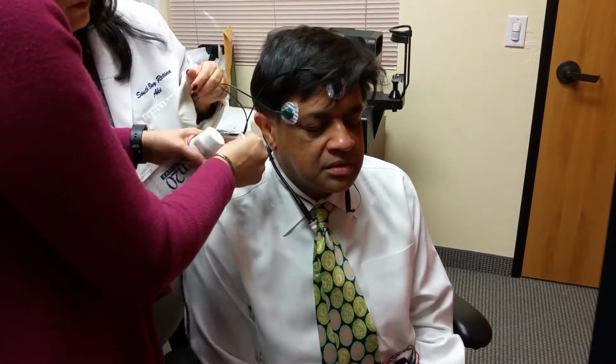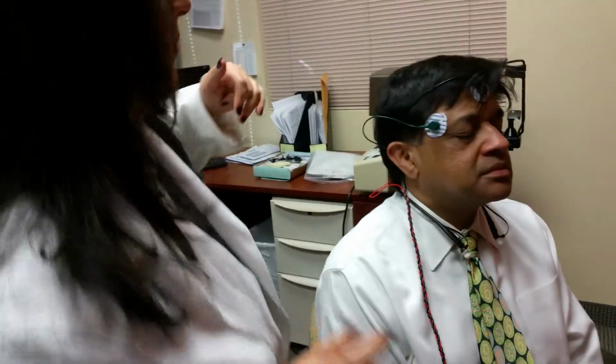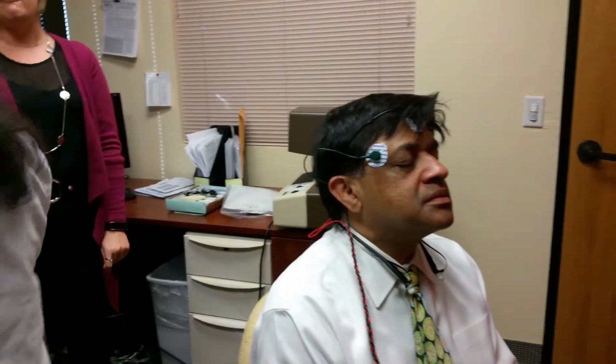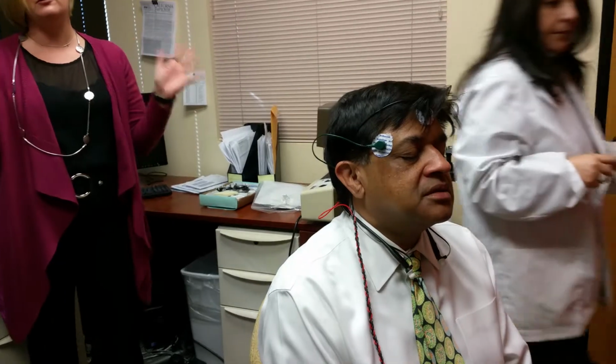Okay, what we're gonna do, don't pull on it. So what we're gonna do is just get that out of his way, and we're gonna tuck this right behind his ears. But anyway, the doctor was like, oh my gosh, I need to start treating this patient. Well, whenever they walked out of the room with the patient, I went to put the trial lenses back up, and I realized they didn't have the right correction in the trial lenses. So we had to bring her back in, fix that, and we retested her. Beautiful results. So correction makes a huge difference. But I was able to see the pattern quite clearly.